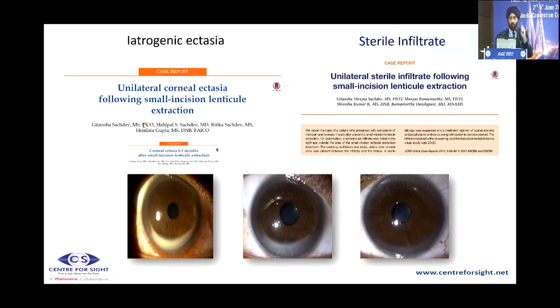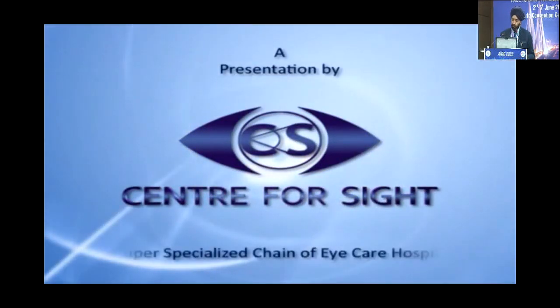So you have to follow the same mandates that you follow for LASIK as you follow for SMILE. SMILE may be potentially better as regards the biomechanical strength, but do not overstep the caution. And in such borderline cases, we do SMILE Xtra, and SMILE Xtra tends to work much better than LASIK Xtra. Thank you very much for your kind attention.